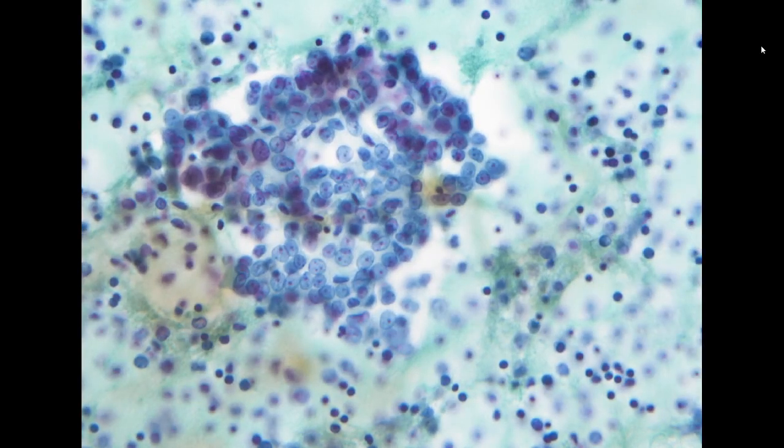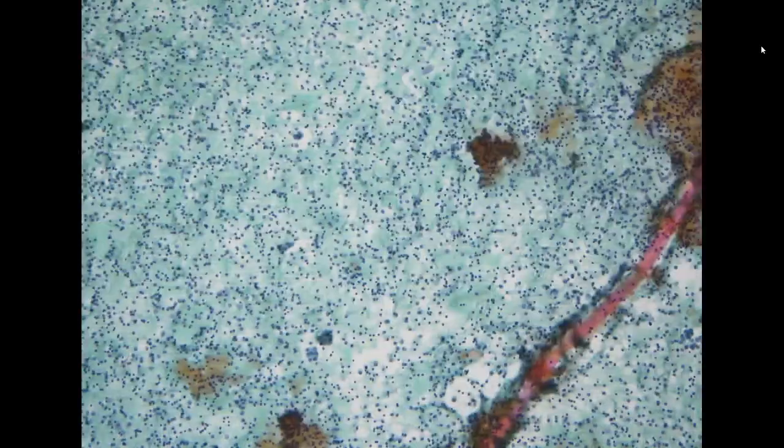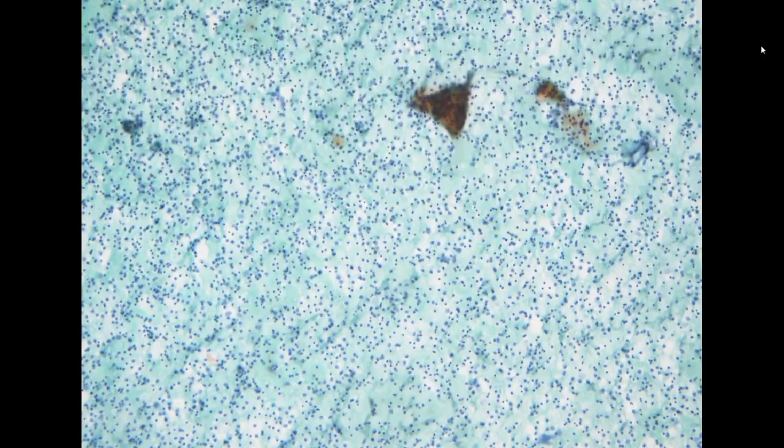So the differential diagnosis will be, is it carcinoma, metastatic carcinoma, or is it reactive mesothelial cell? So this is one of the most challenging areas for body fluid cytology. The first thing is that it is always very informative that we know our enemy first. So in this case, our enemy is thymic carcinoma.